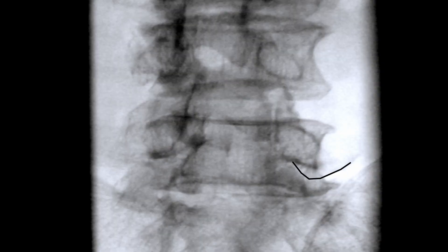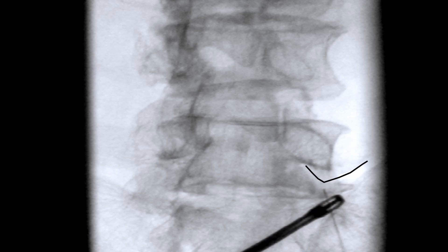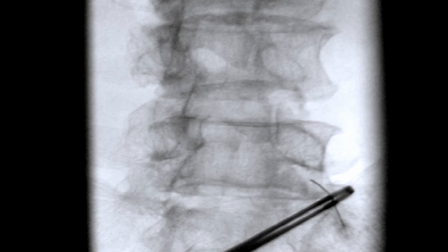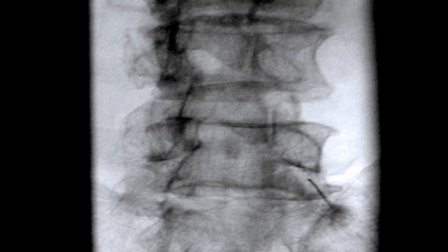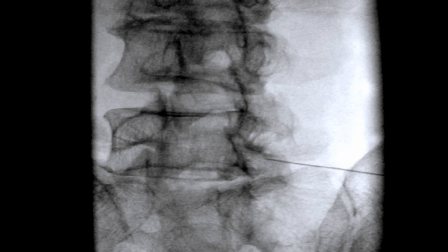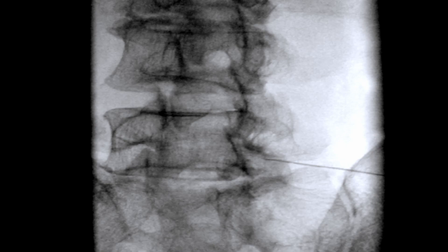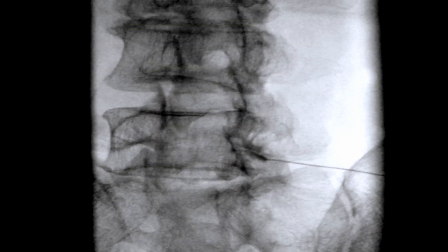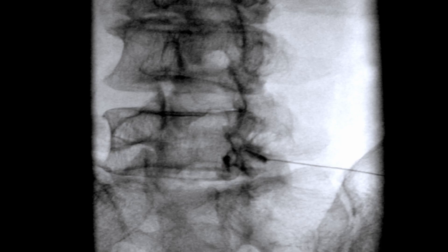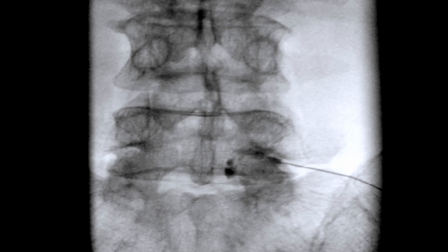In this initial presentation, the subtle bone shadow of the transverse process's inferior border might be challenging to notice when observing through the ipsilateral oblique C-arm view. I located this shadow, which prompted me to make the skin puncture a bit lower than the usual entry point. Please diligently track the needle's progress and directional shifts displayed in different C-arm angles. You'll witness the needle pausing right at the outer boundary of the pedicle's circular shadow. Visualizing the path of the nerve root, you'll then discern the contrast extending into the epidural space. Upon closely examining this contrast flow, it becomes evident that the needle's tip is situated in the posterior epidural area, indicating that the needle has yet to traverse beyond the nerve root's upper margin into the anterior epidural section.